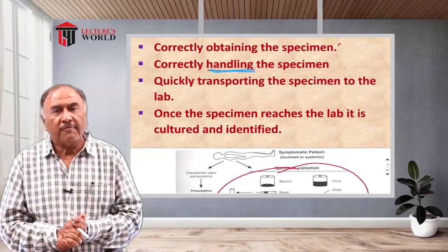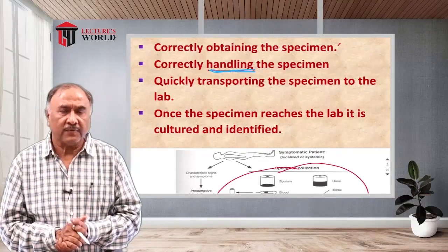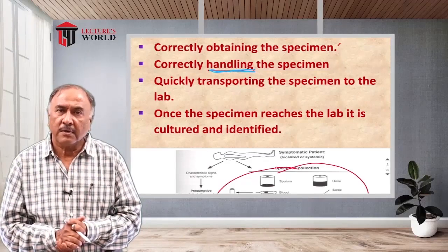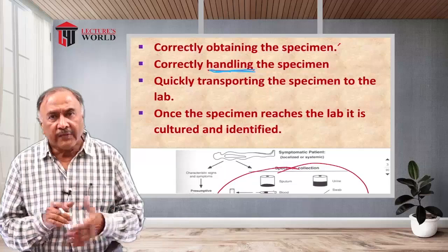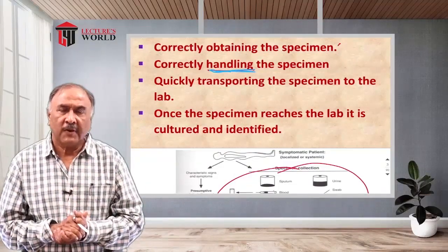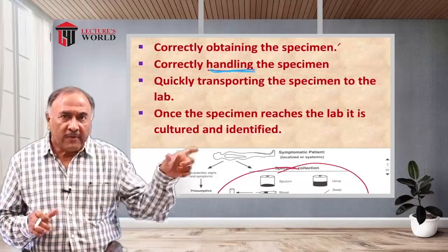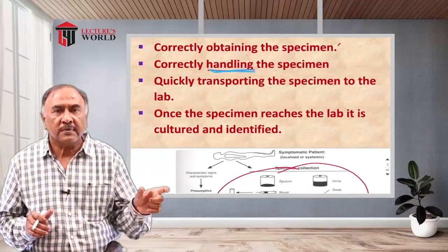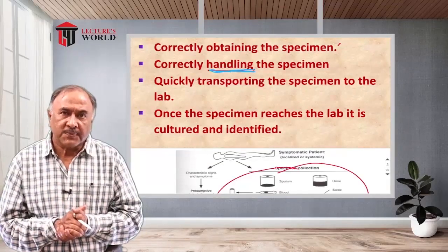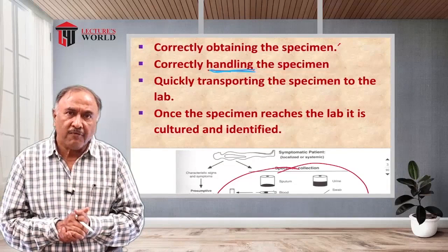Laboratory can be at far distant places. Sample collected from a rural area has to be sent to the city for analysis. Now, during this time period, it is to be seen that proper transportation procedures are being followed.